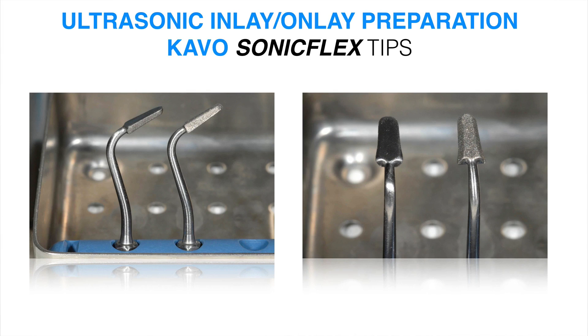I'm using the Kavo Sonic Flex Scaler with specially designed tips. If you were to look on the Kavo website, look up Kavo Sonic Flex Tips, and you look at preparation tips, these are specifically designed tips to prepare box forms and posterior teeth. And I use these for inlays, onlays, and even for direct class 2 restorations.